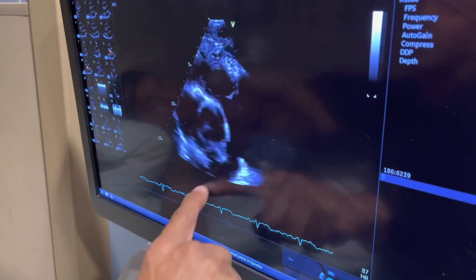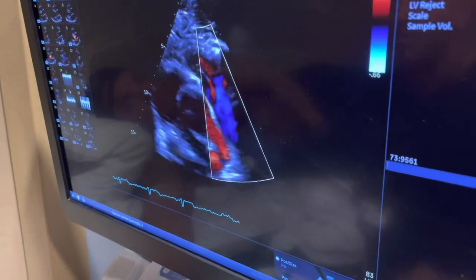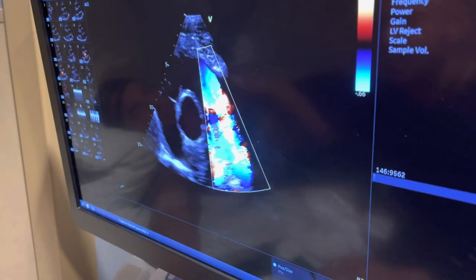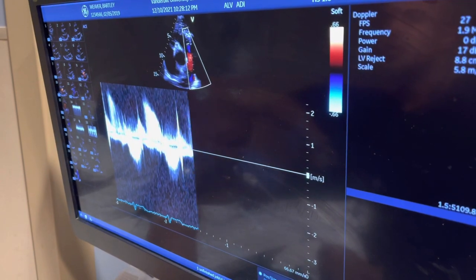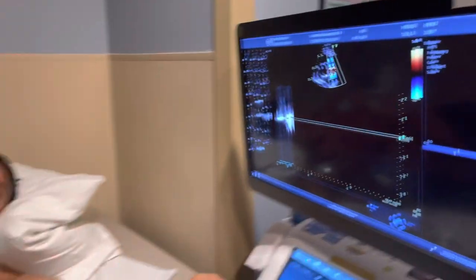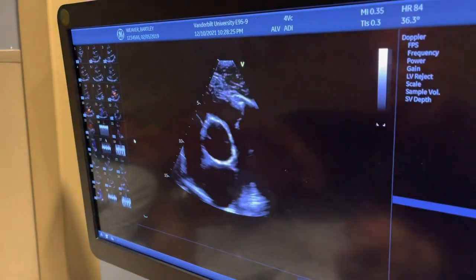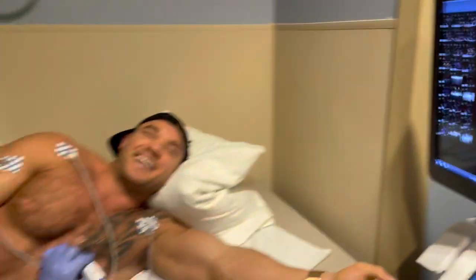We put the color on and we can see the flow. It's a bit of a weird view — you're not really seeing the entire heart. It's just a cut from the top. We're cutting the heart from here, not seeing the entire heart yet. The next image will show all four chambers. So far everything looks perfectly normal — you've been doing this about 16 years.